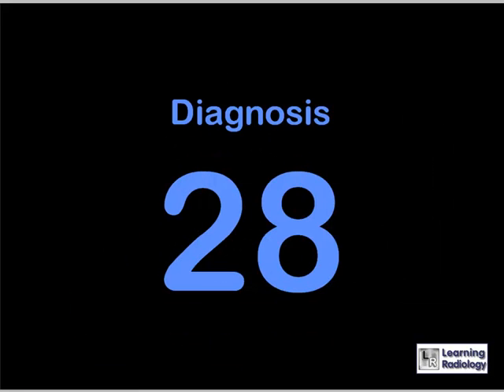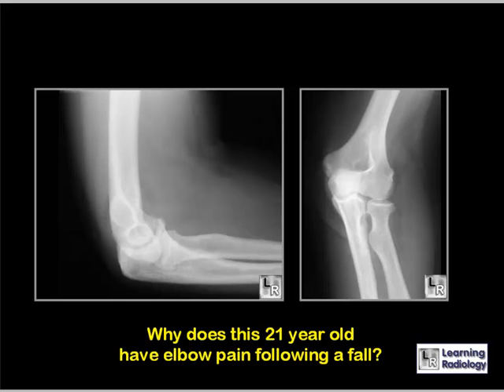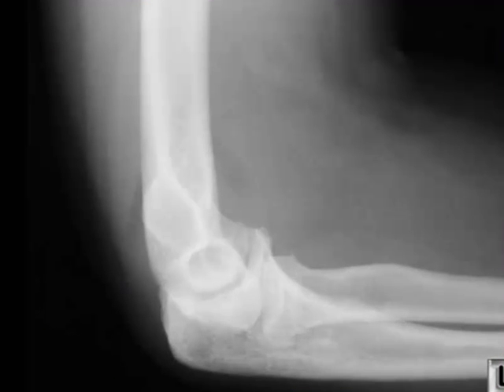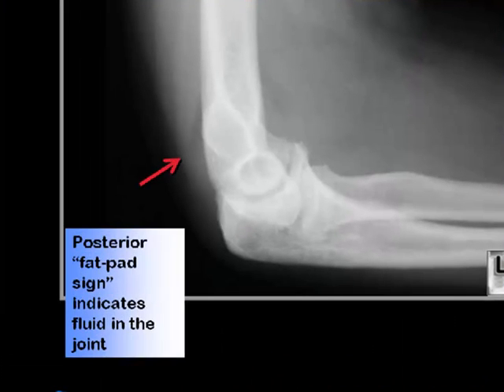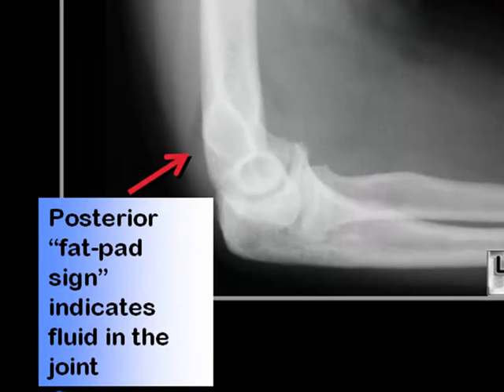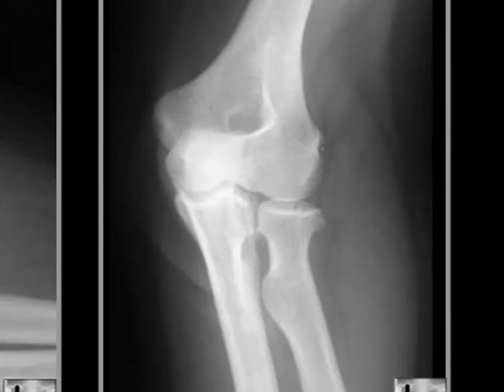Why does this 21-year-old have elbow pain following a fall? On the lateral view, there is the posterior fat pad sign — a triangular lucency (red arrow) extending posterior to the distal humerus, indicating extension of the joint capsule by fluid. On the oblique view, the green arrow points to a lucency representing a fracture of the radial head.